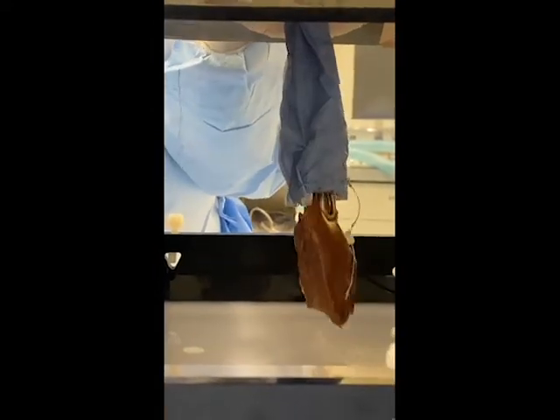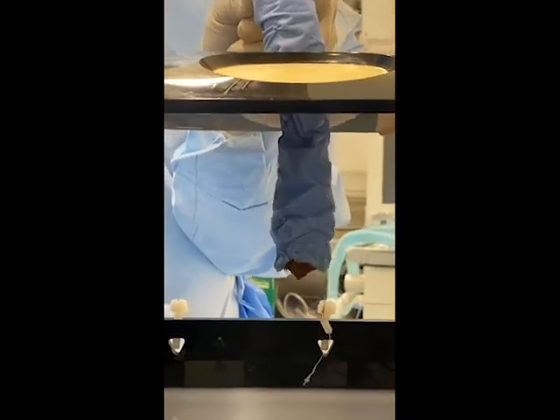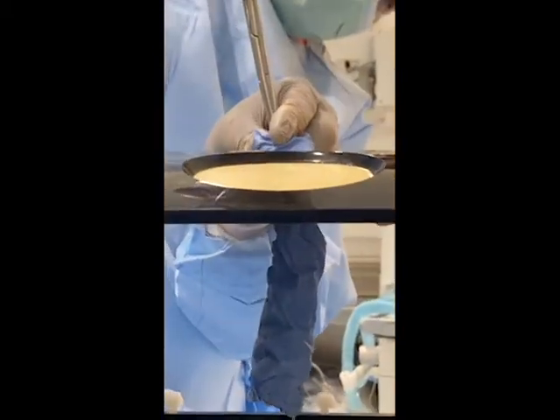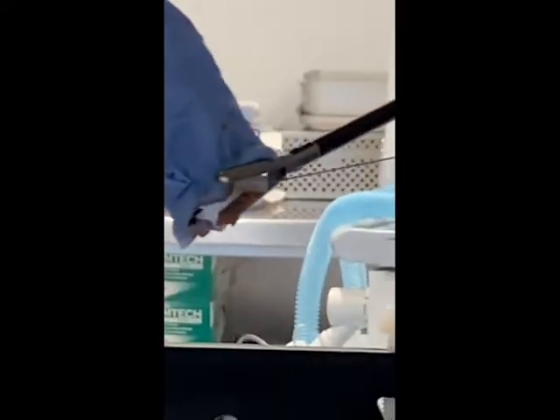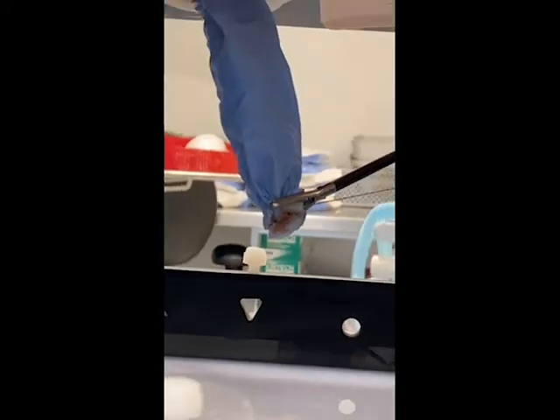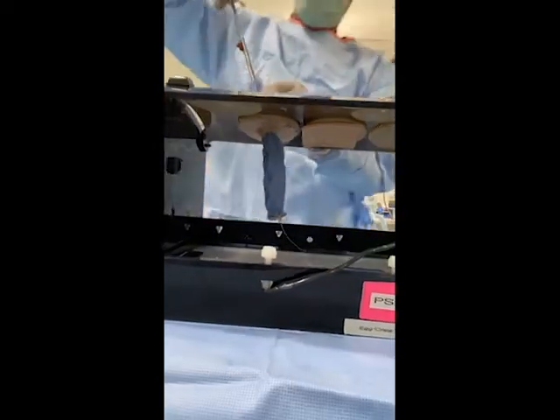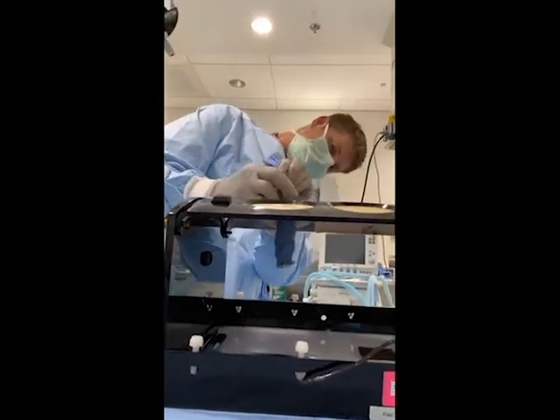This is another example with a piece of liver. The specimen is brought into the sleeve as far up as possible, and then the cinching mechanism is applied, which should all be performed laparoscopically, and the specimen removed.